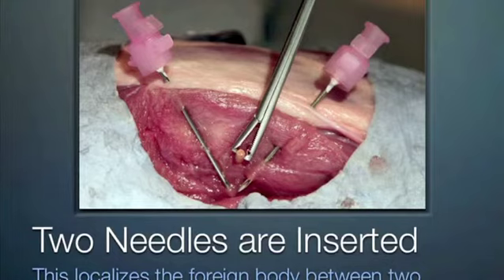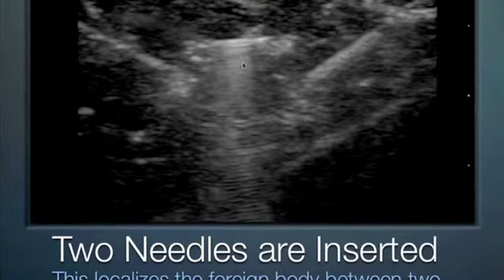We took one needle here coming across, another needle coming here, and this is the actual grasper here with this reverberation artifact grabbing the wooden toothpick. So these two needles can localize the location in which to put the grasper.